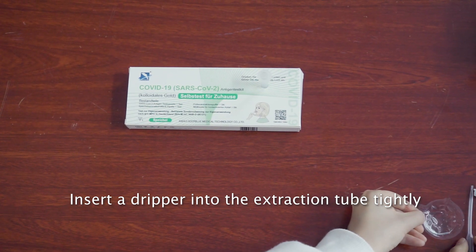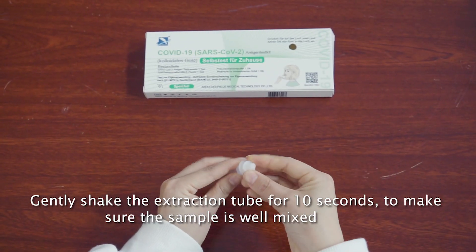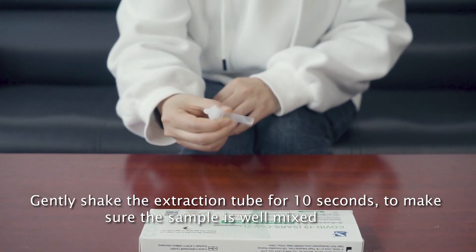Insert the dropper into the extraction tube tightly. Gently shake the extraction tube for 10 seconds to make sure the sample is well mixed.